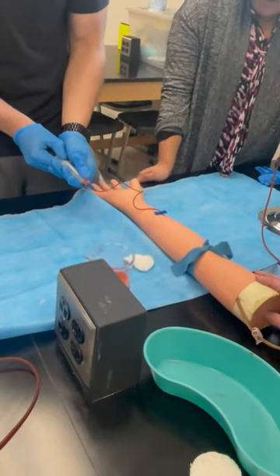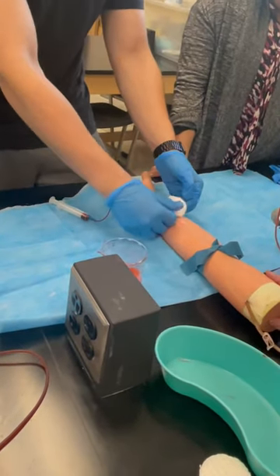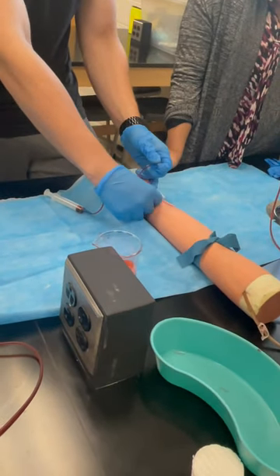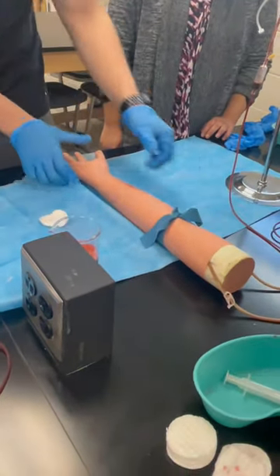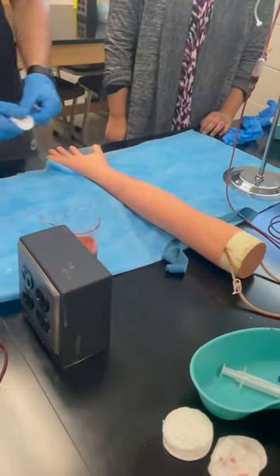Okay, you can go ahead and stop. Hold the cotton swab over the needle and then with the other hand pull out the needle — and don't recap any of it. Put it all in here. And then you guys need to take your tourniquets off because their arms are going numb. That's the worst part. All right, you got it.